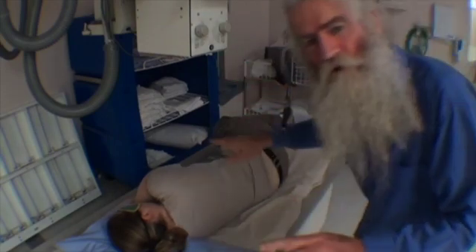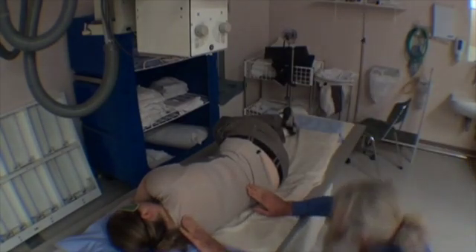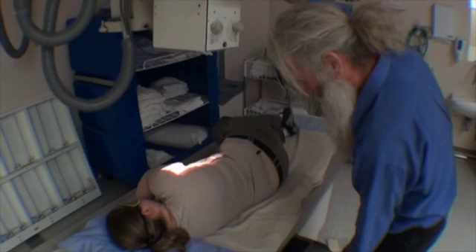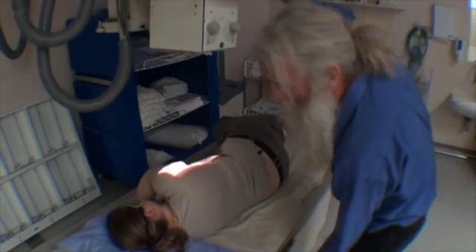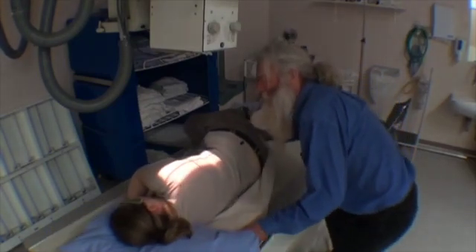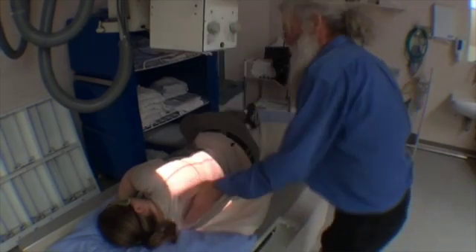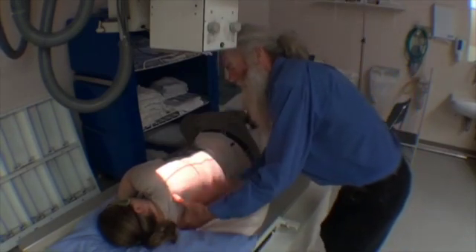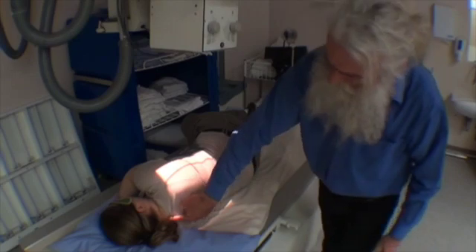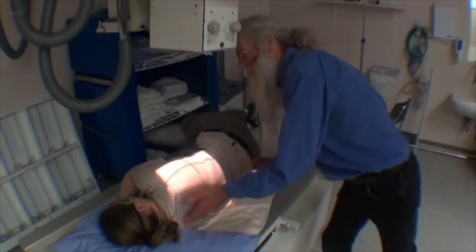Now, if I wanted to, I could go down and look very carefully at the way the back was actually bending, as I did many times when I was training myself. That's pretty predictable — I'm going to be aiming at five degrees. I'm going to be centering to the middle of the bucky. The collimation is still set from the one before, so the collimation is exact. I'm going to spin around a bit to make sure it's going up and down. We're going to do some very tight collimation here as well. We're straight between the collar blades, just down here — there's C7. And so that's our positioning for the lateral thoracic spine.